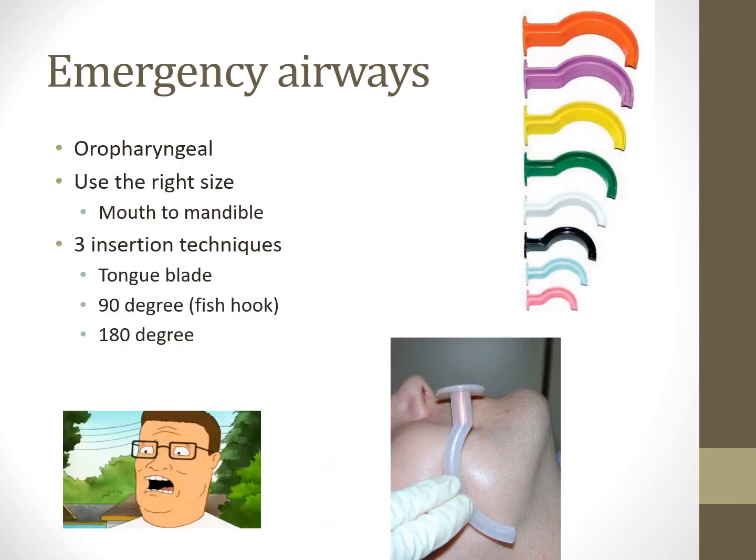So make sure you understand the difference between the two and when you would use a jaw thrust versus a head tilt chin lift. Oropharyngeal airways, these are very crucial, especially if you're trying to pre-ventilate a patient for intubation. Usually we'll put an oropharyngeal airway in to help our bagging be more efficient, because that keeps the tongue out of the back part of the oropharynx.